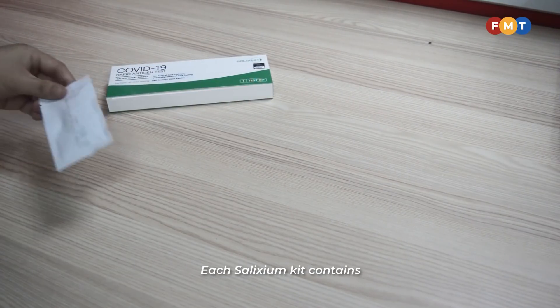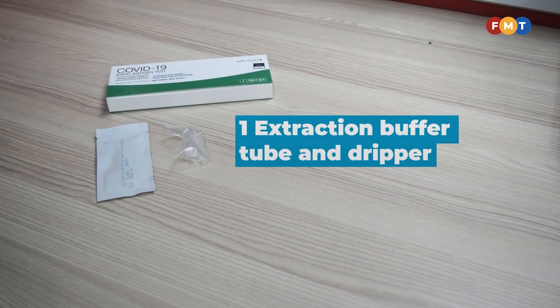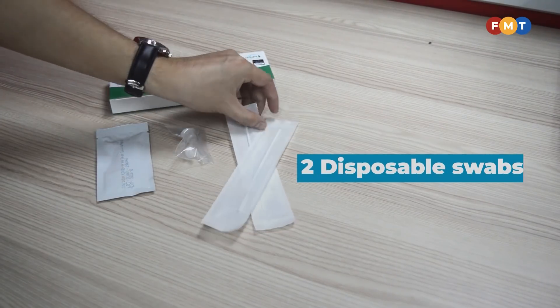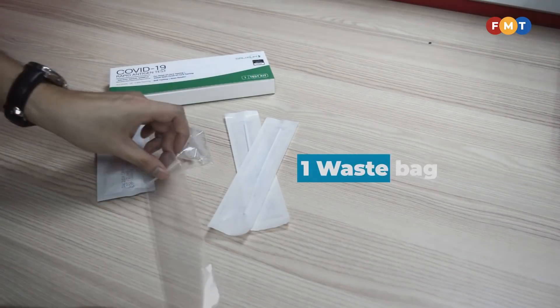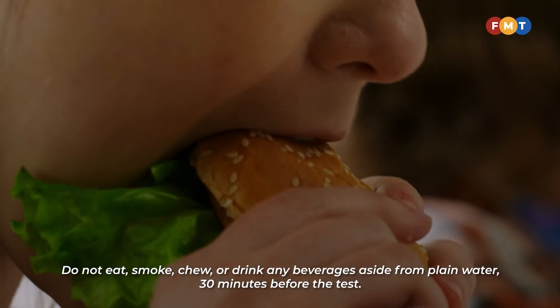Each Salixium kit contains one COVID-19 Rapid Antigen Test device, one extraction buffer tube and dripper, two disposable swabs, one waste bag, and one instruction paper.